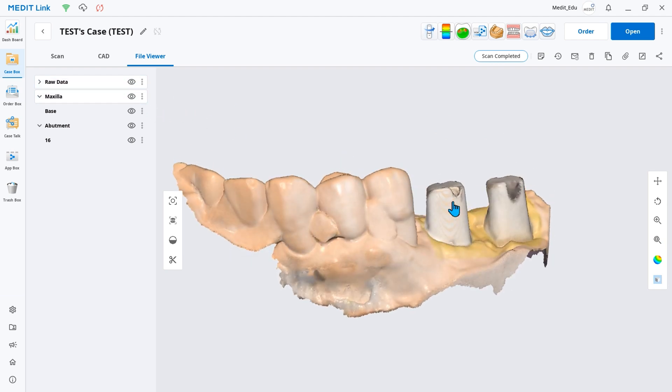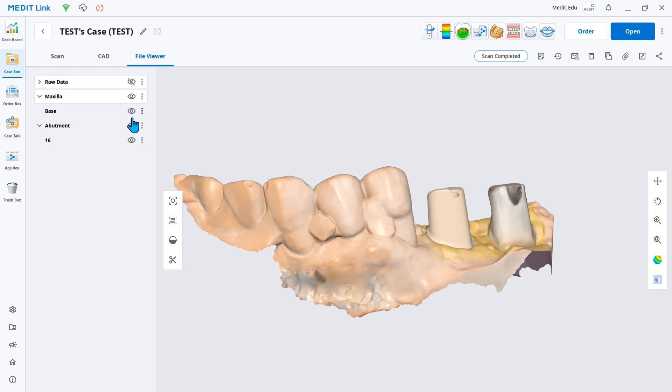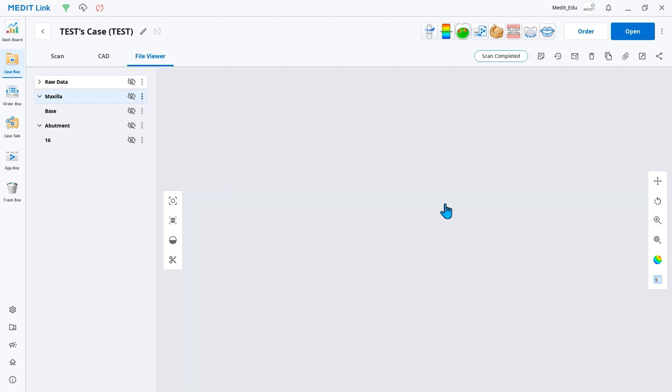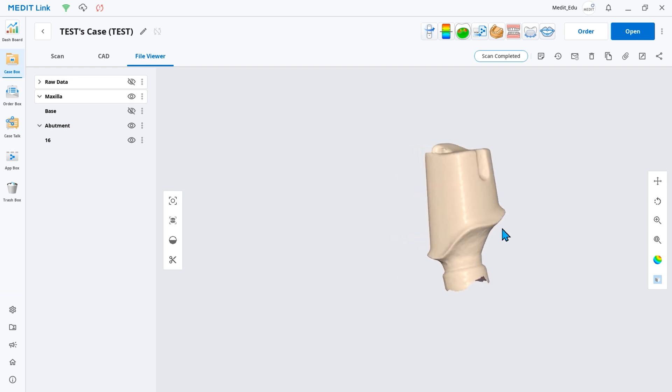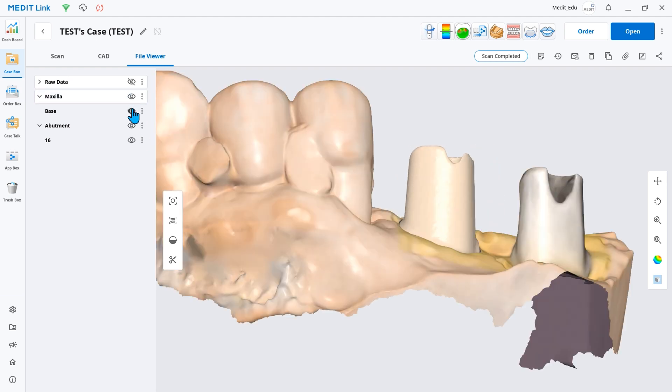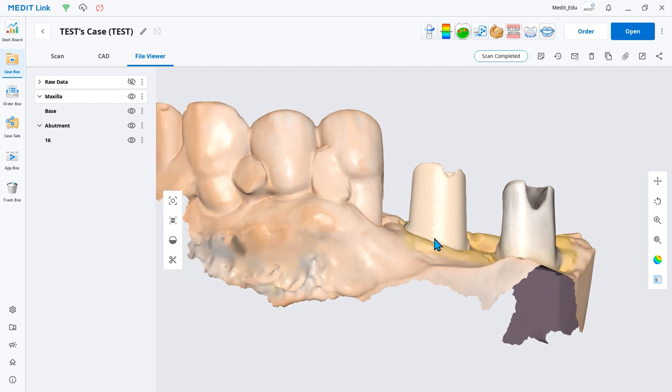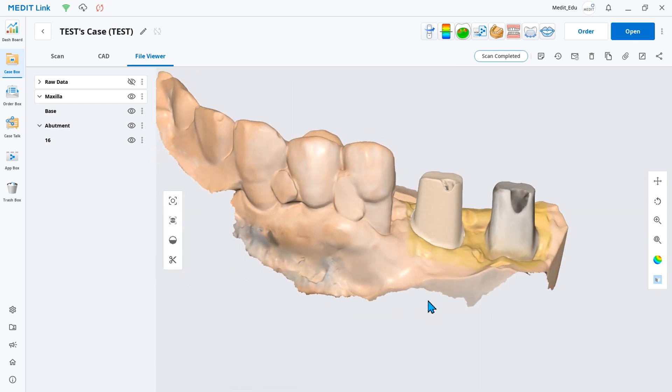You can send the associated abutment library file with its 3D location when ordering to your partner laboratory. This is also useful when you need to do additional design work in ExoCAD.